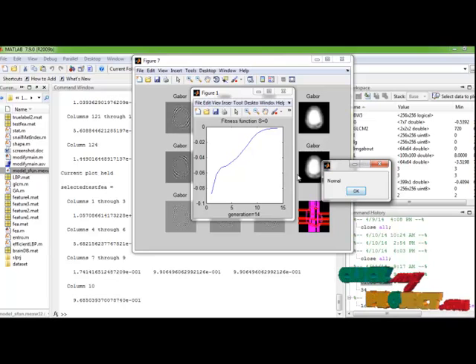Then the results are obtained. First figure denotes the normal image and the second figure denotes the preprocessed image, i.e., noise is removed and the filter is applied. Then the fourth or fifth is the segmented tumor part. The affected area tumor is segmented and displayed in this result.